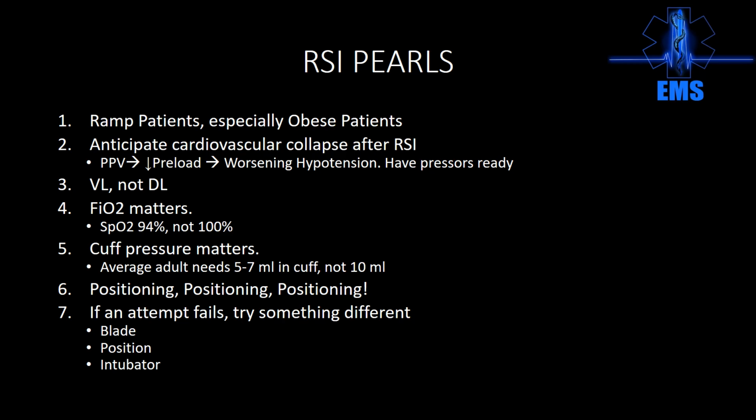I can't say it enough, folks. Positioning, positioning, positioning. If you walk away from nothing else from this topic or from this talk, remember external auditory canal, align with the sternal notch, ramp up obese patients, positioning. As long as you position the patient, your first pass success will be much higher.